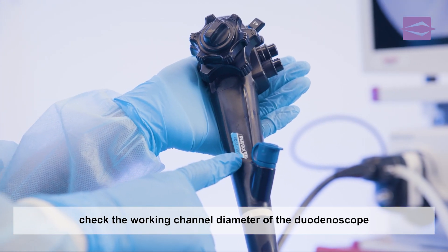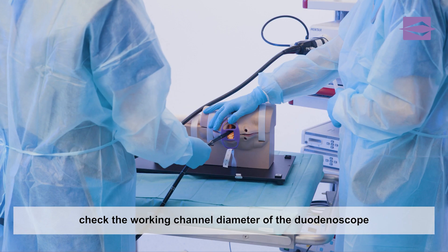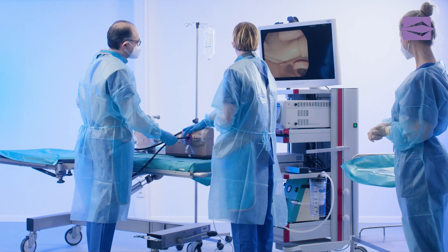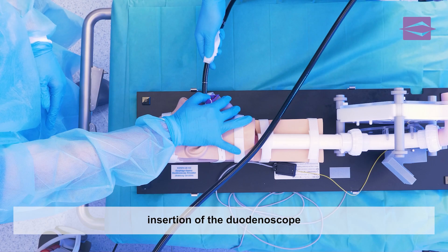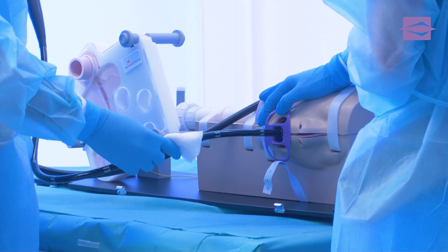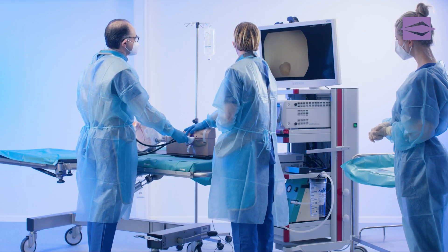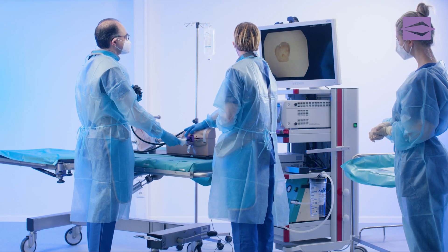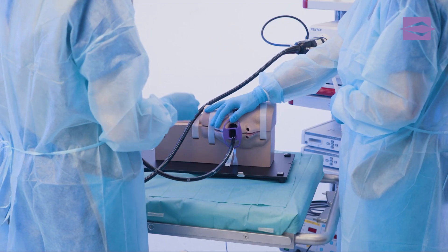At the beginning of an ERCP, the examiner makes sure that the working channel diameter of the duodenoscope used is adequate. The duodenoscope is carefully inserted into the patient orally, and the examiner continuously observes the advancement process on the monitor. The examiner advances the distal end of the duodenoscope until the target, the papilla, can be clearly identified through the lateral optics.